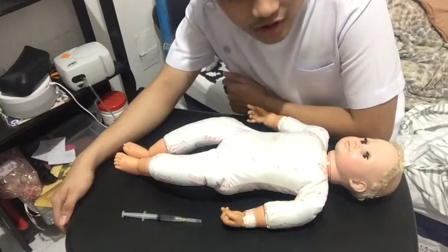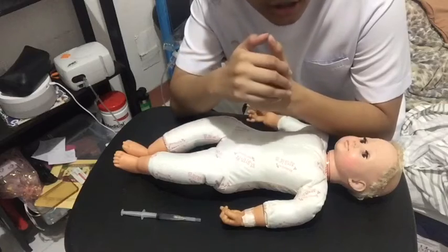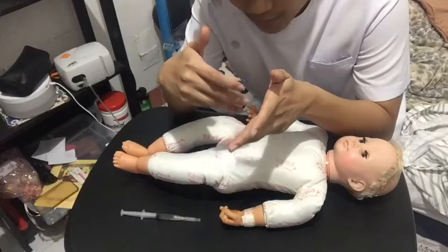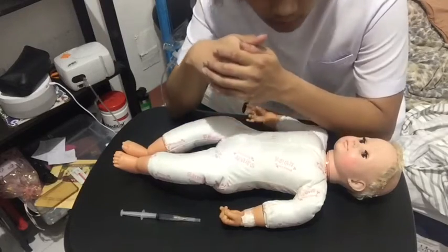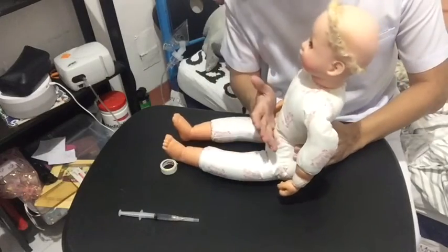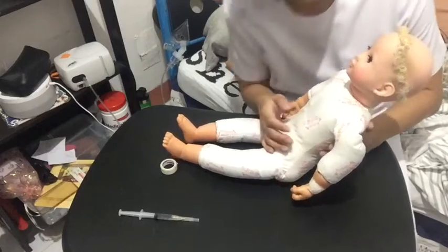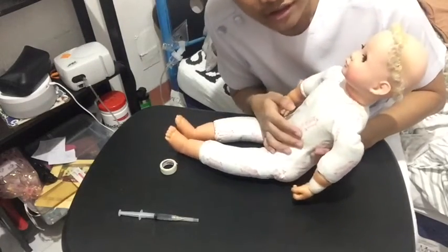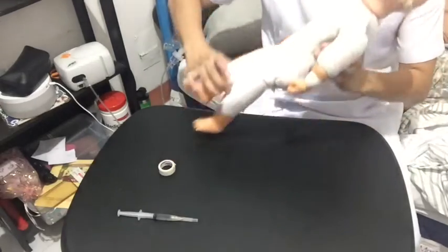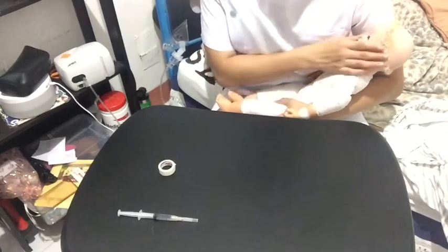And after giving the mother a brief explanation on what we're going to be doing, if the client is not a baby, what we usually do is we tell the client to sit in a seated position, or more preferably a semi-Fowler position. The purpose of this is to help in lung expansion, which is easier for the lungs. But since this is a baby, what we usually do is we aid the baby by holding him or her like this.